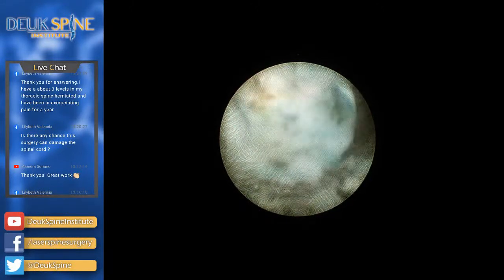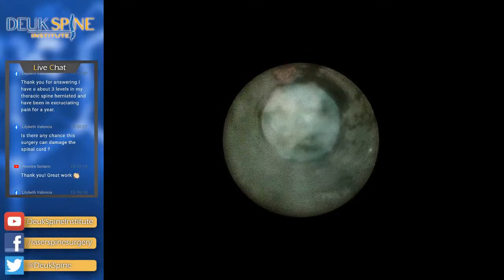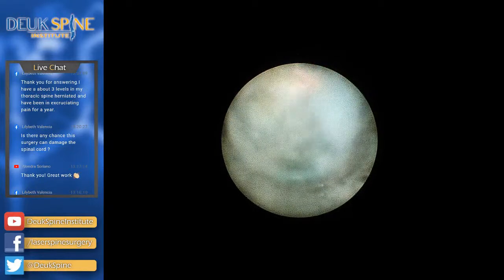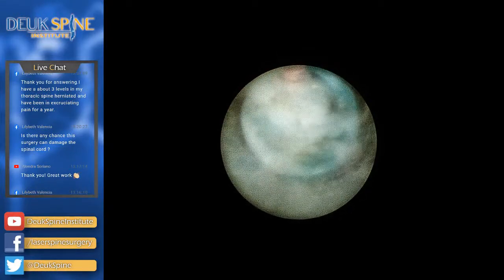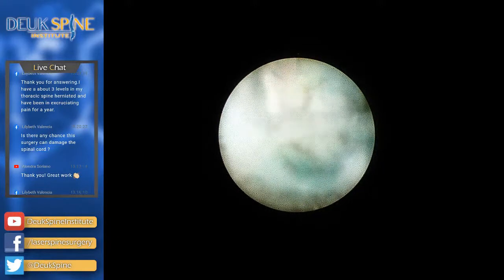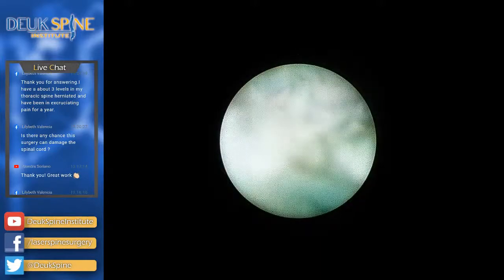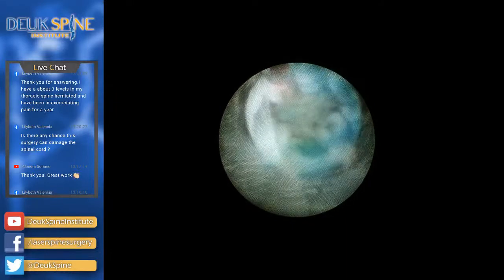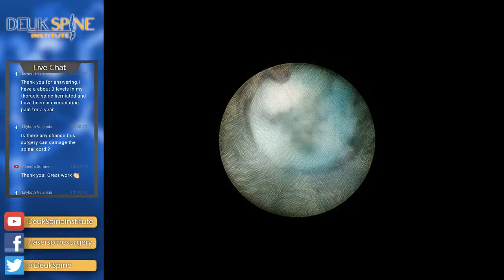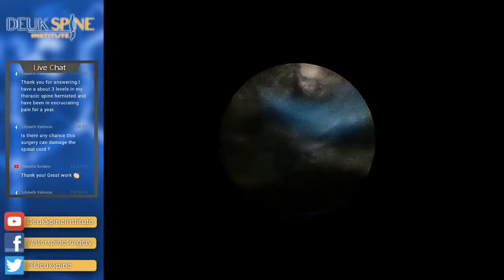This is beautiful. Very happy with what we're seeing here and the undulations of the herniation, the undulating dance of the herniation. It's quite remarkable. So why does the herniation dance the way it dances? It's still overexposed. I need the lights down a little bit. That's better. There's some herniation. So why does the herniation dance? Who wants to take a stab at that one? Oh, look at that herniation. Oh, that's a big one.